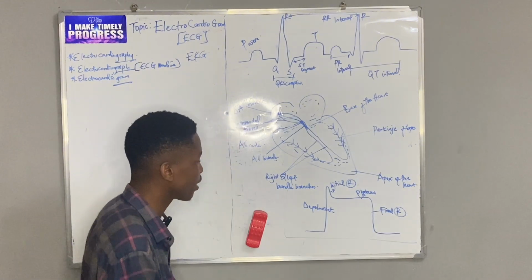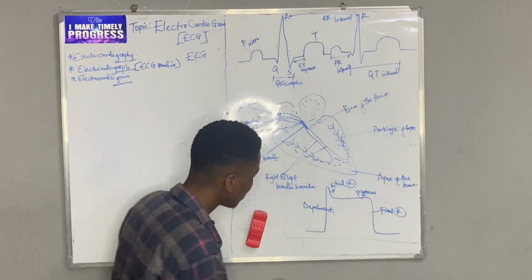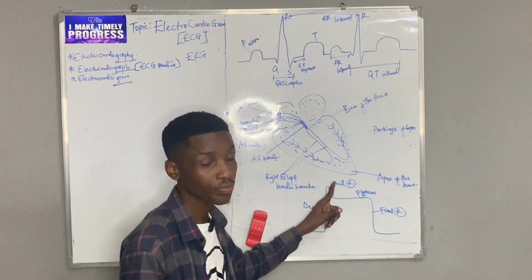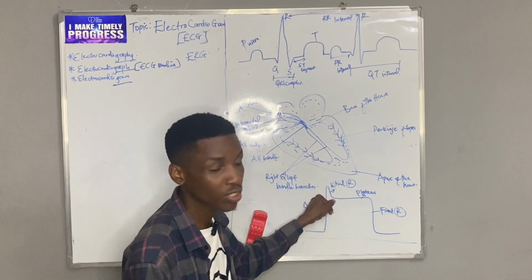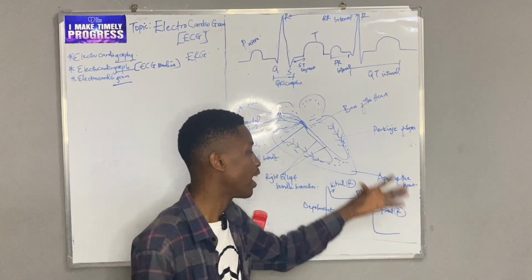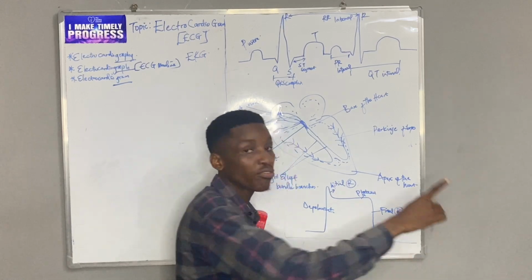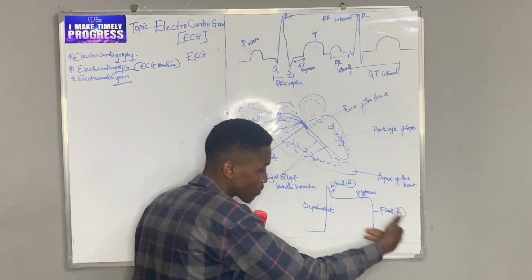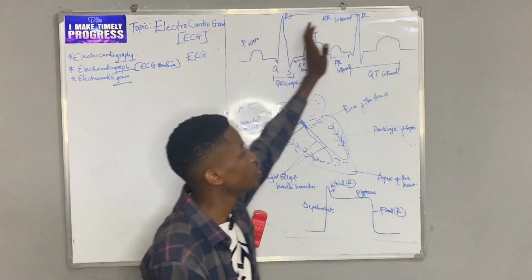So usually when we look at the cardiac muscle, or specifically I would say the ventricular muscle, the action potential is shown this way with an initial depolarization. So we have a depolarization, initial repolarization, a plateau stage, and a final repolarization. So this is how the heart works. So the muscle would first go up, come down, have a plateau, and then fall down again. But these activities that we see are for each muscle. What it records outside is what is going to be shown on these waves.